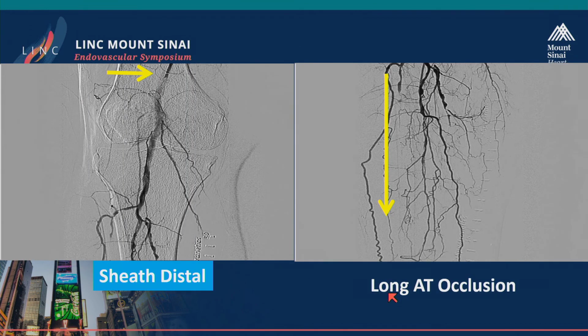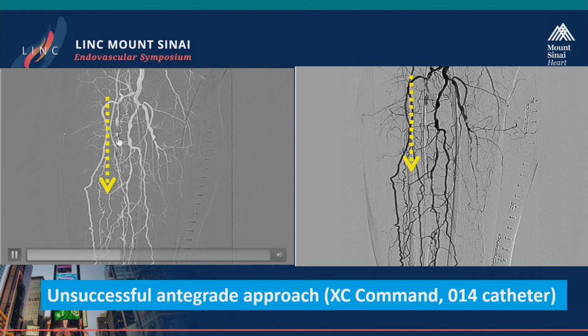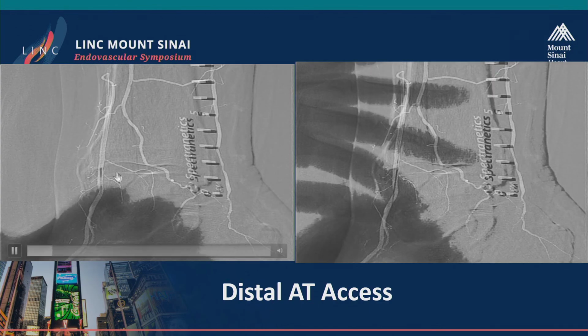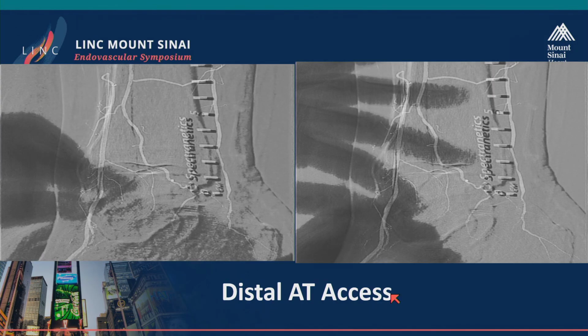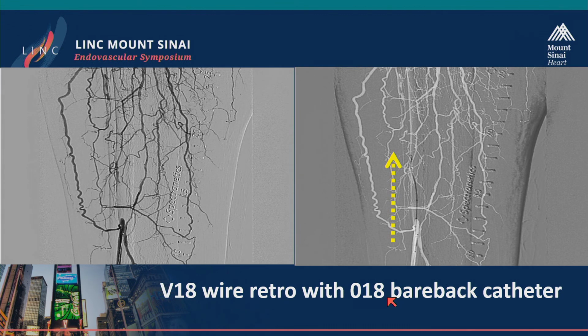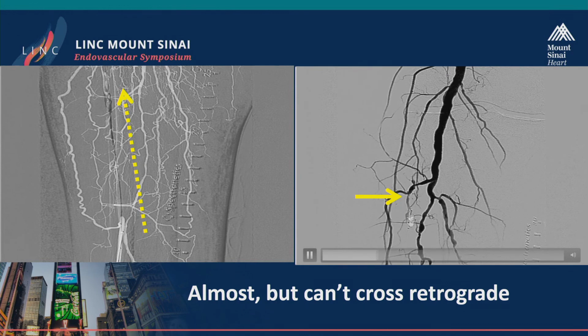You can see a long AT occlusion. We tried antegrade, but really couldn't get there despite several attempts. So again, retrograde is the next option to get through this occlusion. Here we got very close, but couldn't get in retrograde.